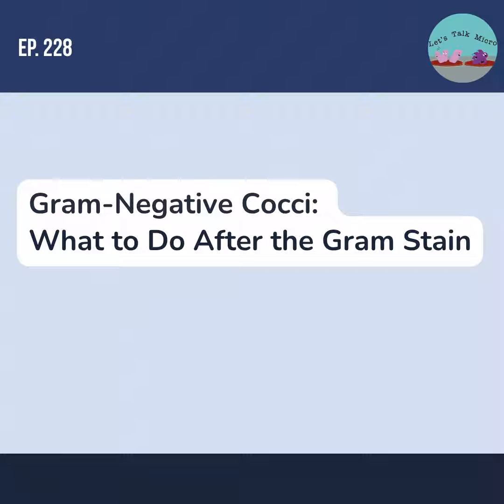Okay, so then you have Martin-Lewis, which is a modification of modified Thayer-Martin. In this agar, instead of nystatin, there is anisomycin for yeast, and there is also a higher concentration of vancomycin. And this plate is intended for the selective isolation of Neisseria gonorrhoeae.